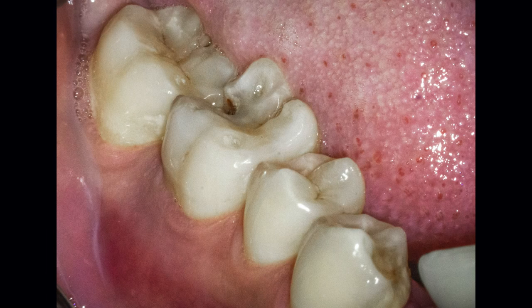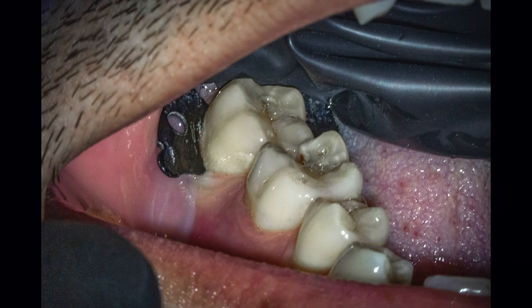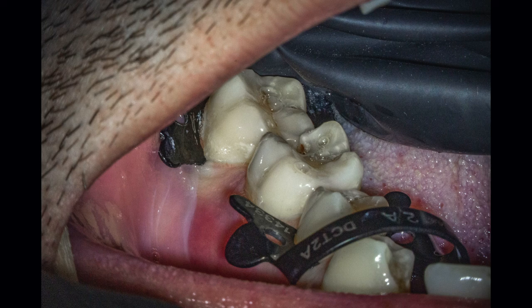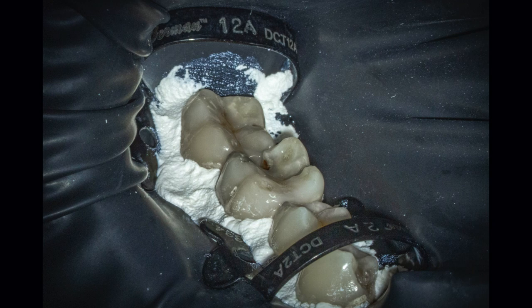The intraoral evaluation shows no signs of swelling or infection, and due to the location of the caries on the distal, it's going to be really challenging to use a traditional single tooth isolation technique. So I chose to use a dual retainer split dam isolation technique with rubber dam block-out material. This allows me to access that distal caries without worrying about running into my rubber dam or having any issues with breaking my aseptic seal.